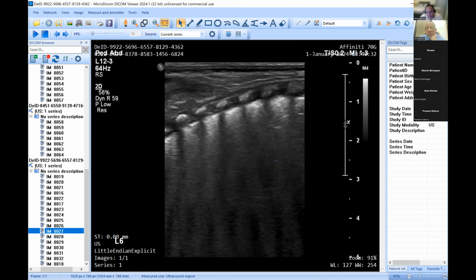So I'd say that the changes you get in cystic chronic lung disease are not reflected by areas that look cystic or lucent on the ultrasound. What you can get in those babies, if you have air trapping, is A profiles alternating with thickened pleura and B profiles. A lot of it depends on the distribution of air, the air-fluid ratio, the area of the lung you're looking at, and whether you've got air within the alveoli right up to the lung margins. If you've got air trapping in one area with alveolar recruitment right up, you'd still get an A profile, but you might get pleura that looks thick and irregular in that region. So there's no typical pattern for that.